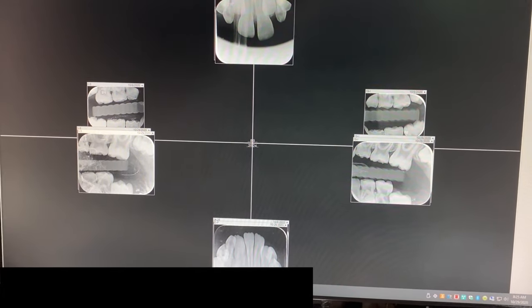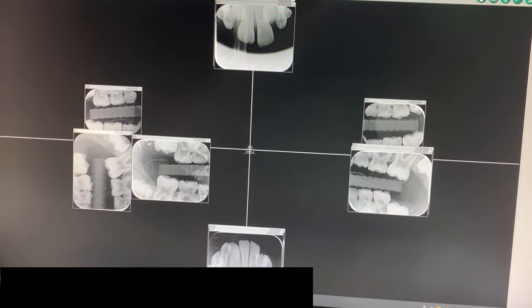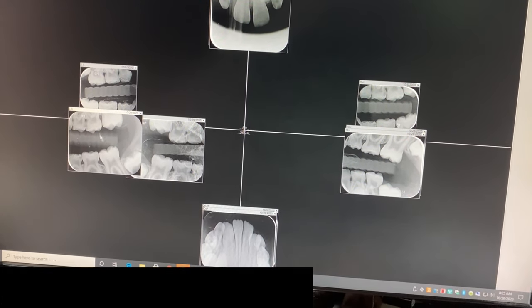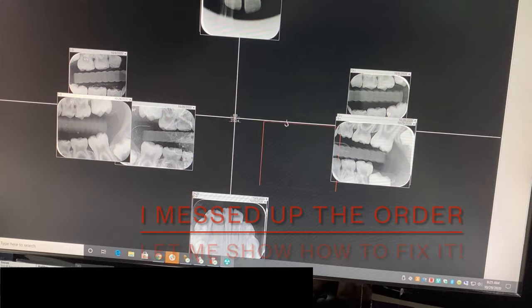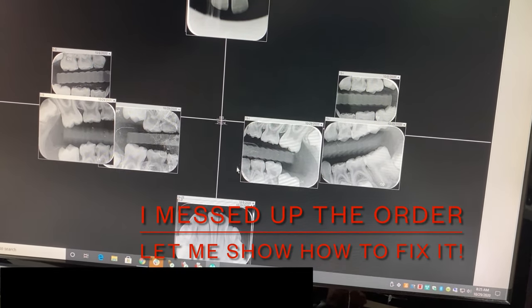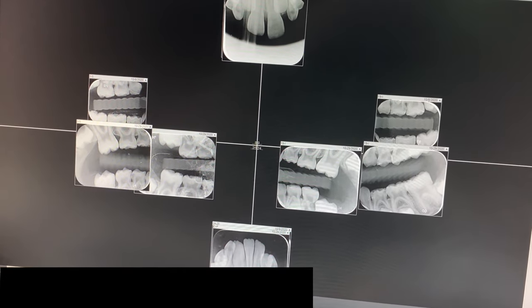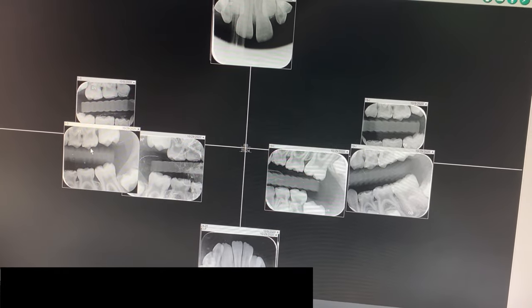This one looks like it needs to be rotated, and probably the one underneath it will too. Oh, I accidentally put them on the wrong side. Let me show you how to fix that — notice this is the right bitewing, but I actually put it on the left.